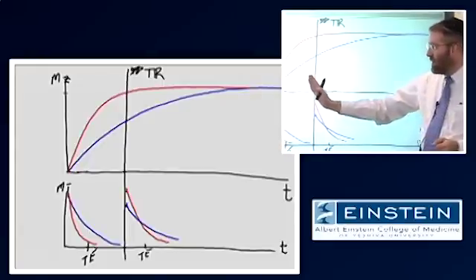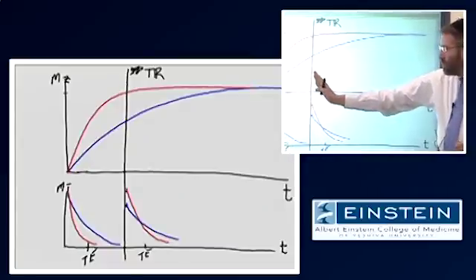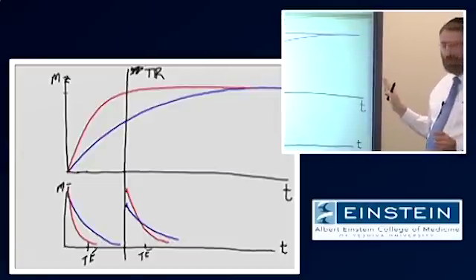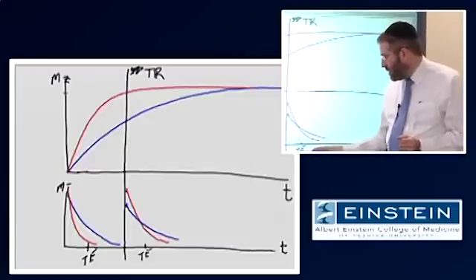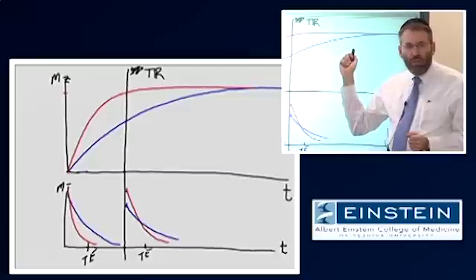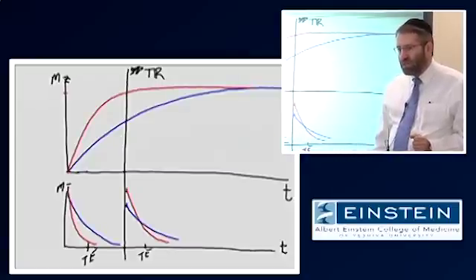If, on the other hand, I'm not interested in those T1 differences, which might be the case, I will want to push this repetition time out as far as possible, which essentially suppresses this information from my image. Okay, at the same time, adjusting the TE really has no impact on the T1 information in the image. It modulates the T2 contrast in the image.